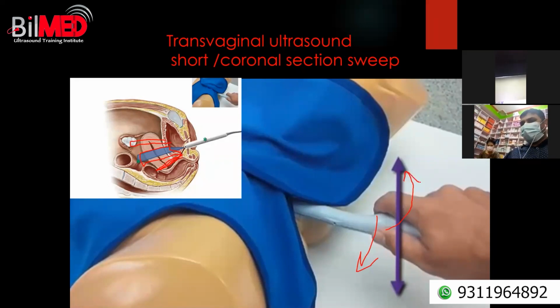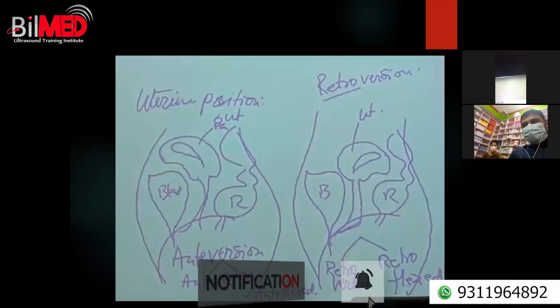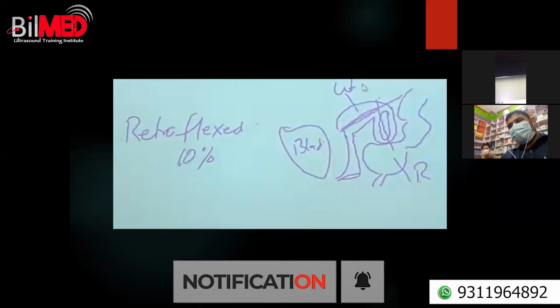So here you have to move your hand up and down, not to the side of the patient. Side of the patient was for the longitudinal section. So for longitudinal, it is from the right to left of the patient, and for transverse, it is up and down. So this is regarding the TVS schedule.